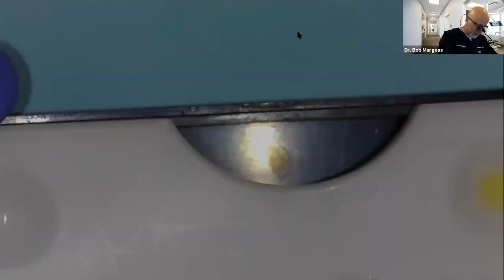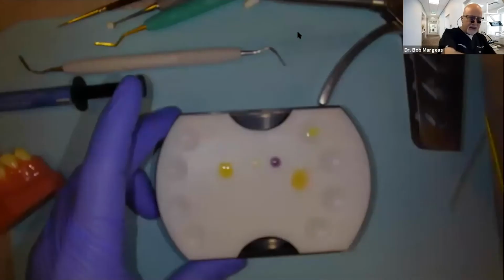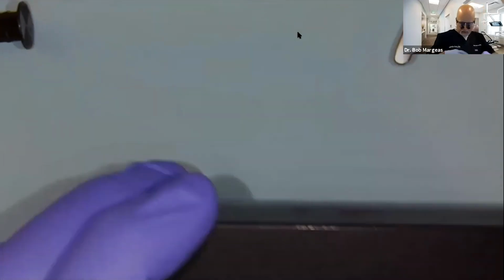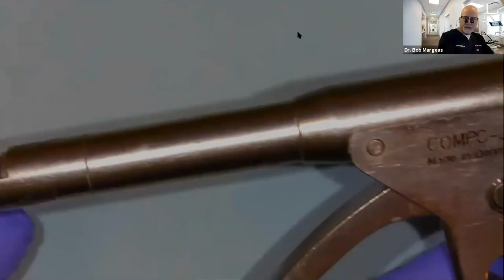And I keep this in a resin keeper. This resin keeper is a light box. And this is from Composite. And my assistant can have this and open it up, take it out. And I have the ability so that it won't cure ahead of time. Some of the instrumentation, this Composite, this is definitely the Rolls Royce of composite guns.